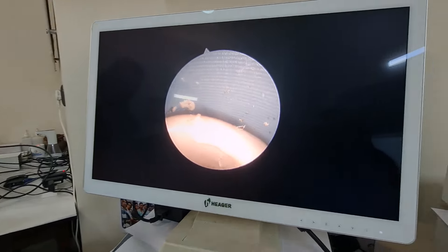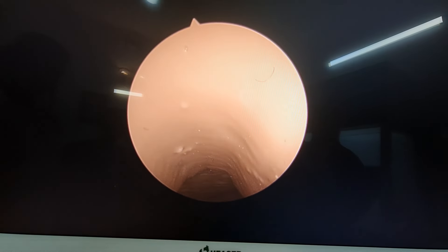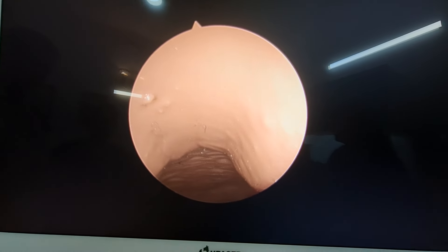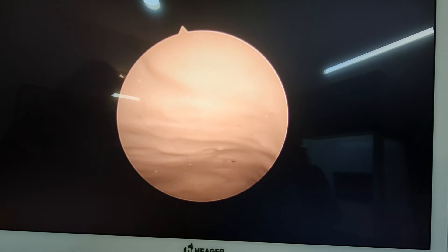First, move inside. Then according to the direction, you have to move your hands. So you have to bring your hands up and then we are entering inside the cervical canal.